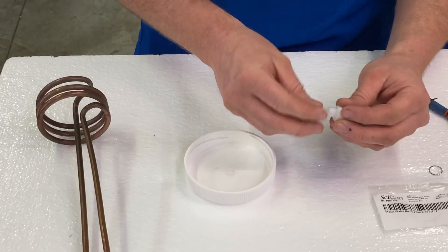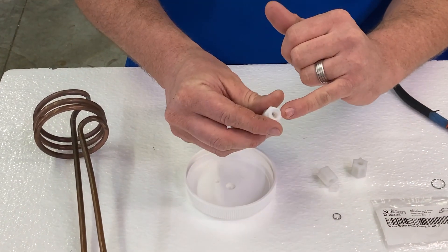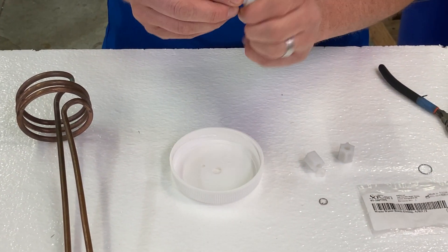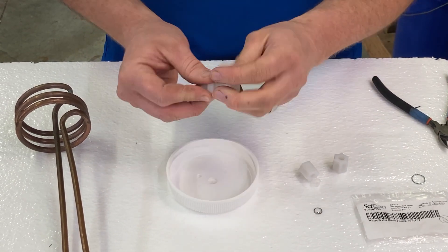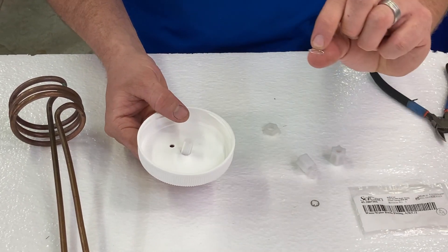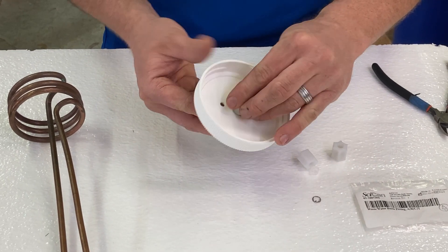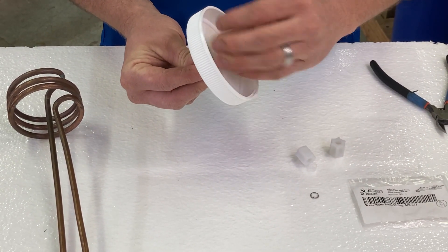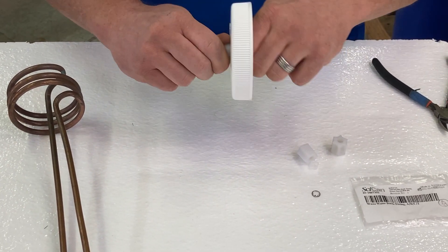The new one, if you will notice, has a shallow end and a deep end. The deep end goes into the bottle. So after putting that through, use the new metal clamp and the plastic nut and tighten that down all the way. And the cap portion is done.